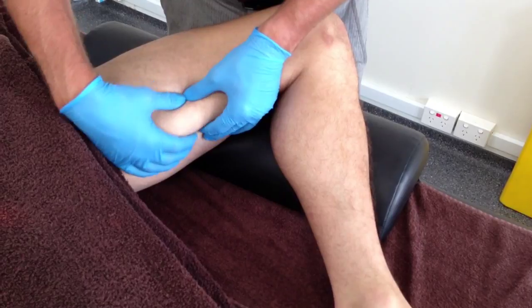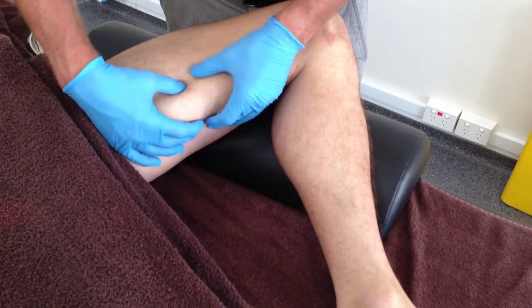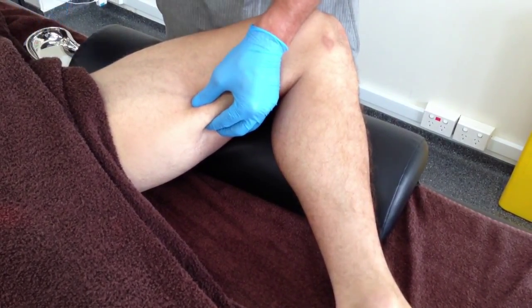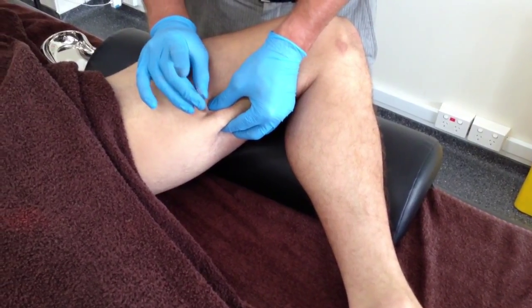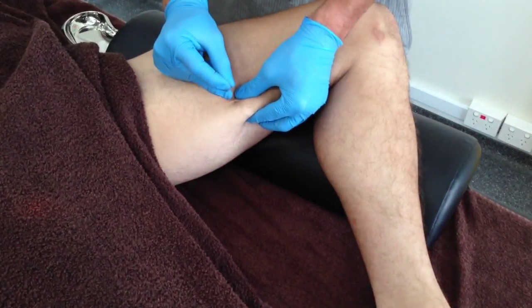With the pincer grip palpation, the semi-membranosis muscle belly can be drawn away from the underlying popliteal vessels as they travel through the adductor hiatus close to the femur. Needling using this technique in an anterior to posterior and slightly lateral direction will also help to avoid the sciatic neural structures.